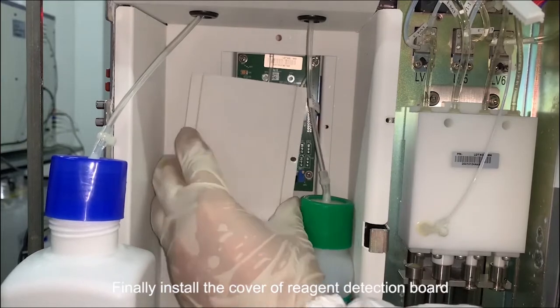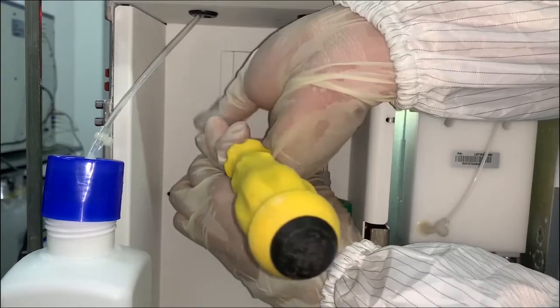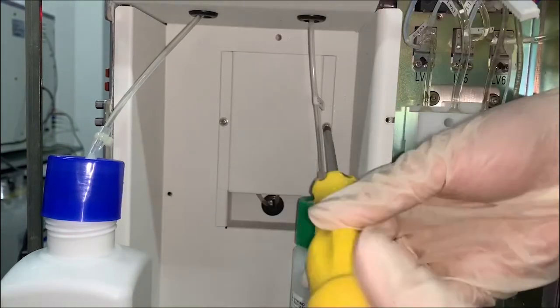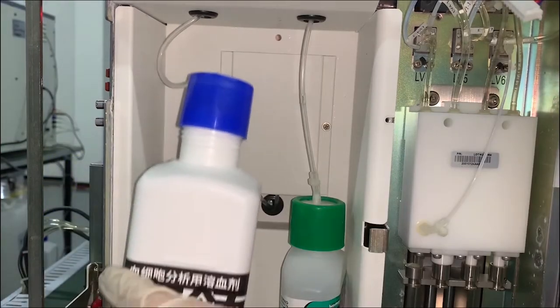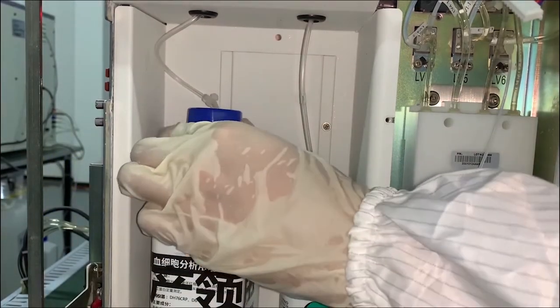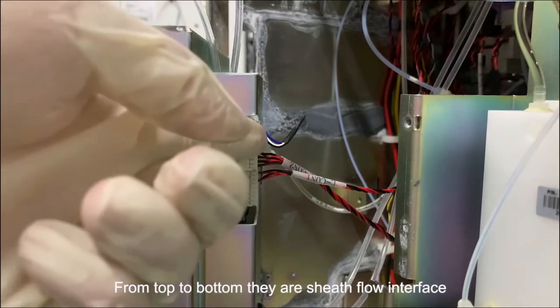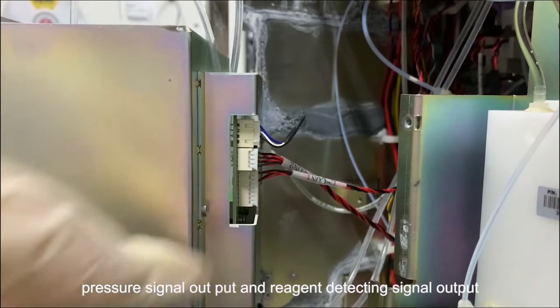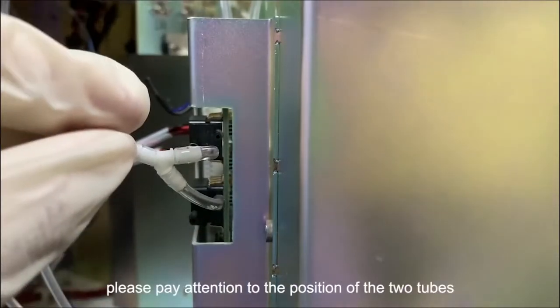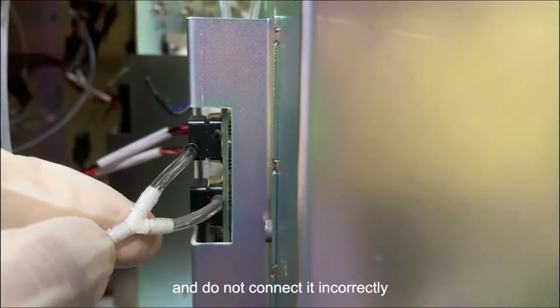Finally, install the cover of the reagent detection board. Behind the board there are three interfaces. From top to bottom there are: sheath flow interface, pressure signal output, and reagent detecting signal output. On the other side of the board, please pay attention to the position of the two tubes and do not connect them incorrectly.